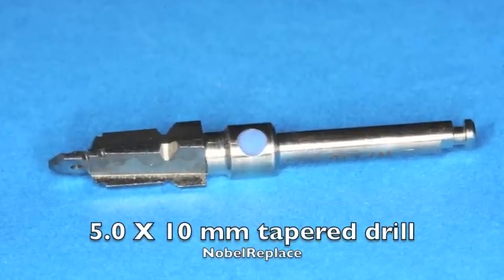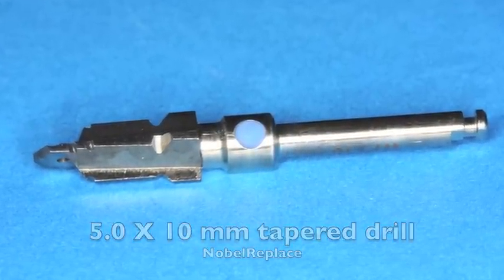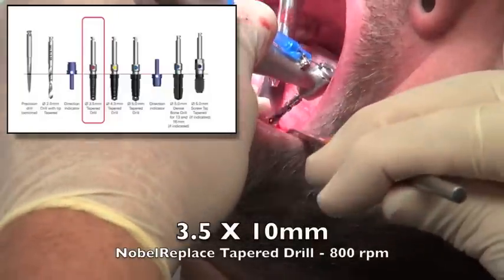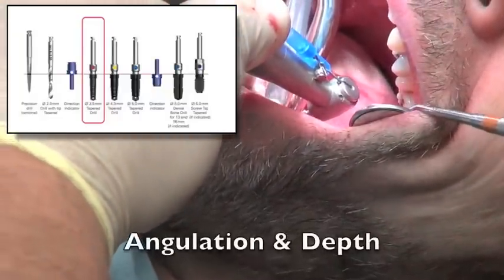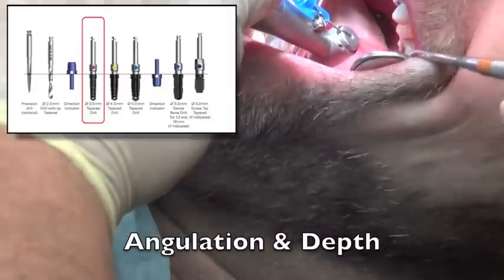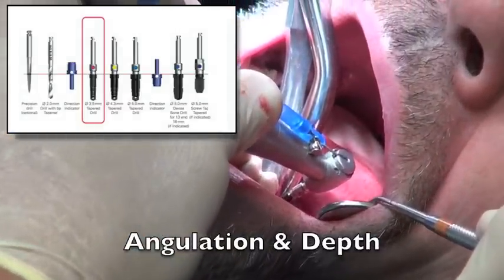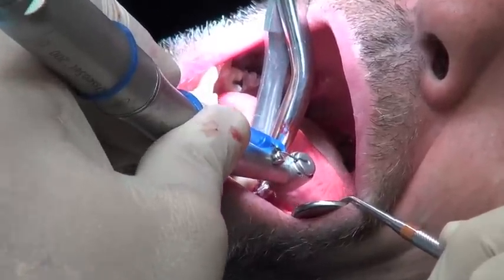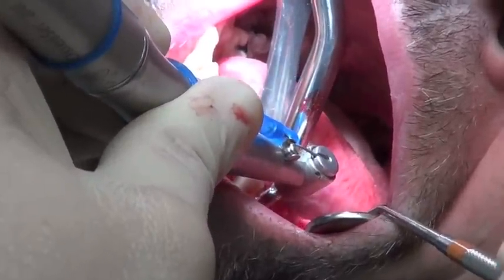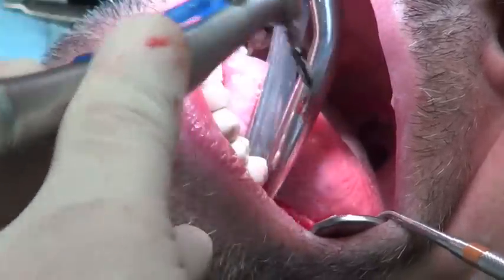During this surgery we'll be ending on the 5.0mm wide drill protocol because we're placing a 5.0mm wide implant. We start with the 3.5mm, shown here in the diagram. We're going to penetrate the ridge, thinking about angulation and depth. It's very important to think of those two concepts because you can actually change the angulation if you don't keep the drill in the right direction. You have to keep on angulation — it's very important.